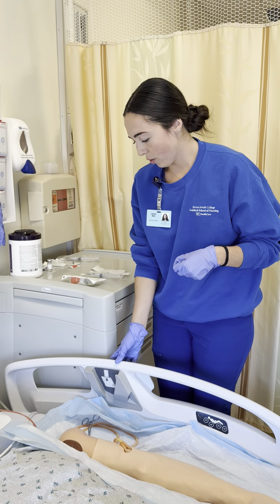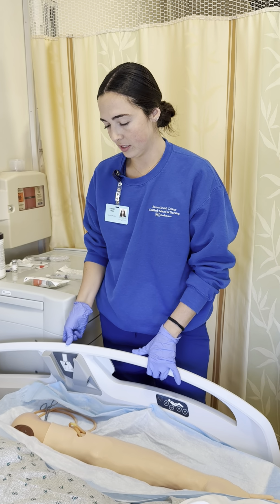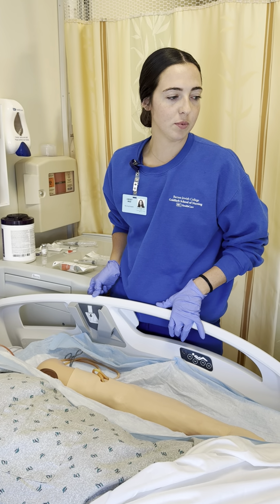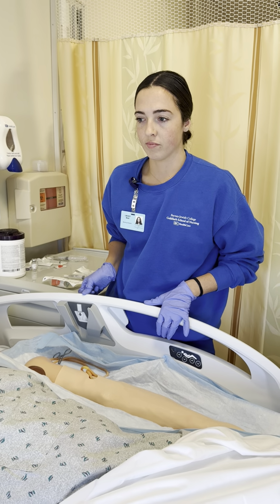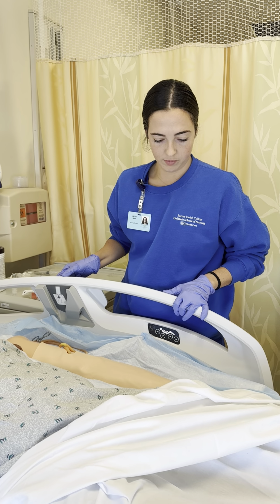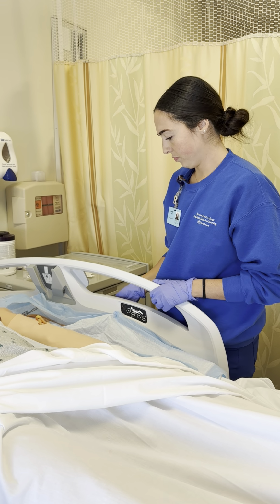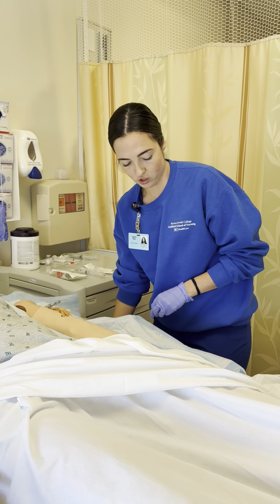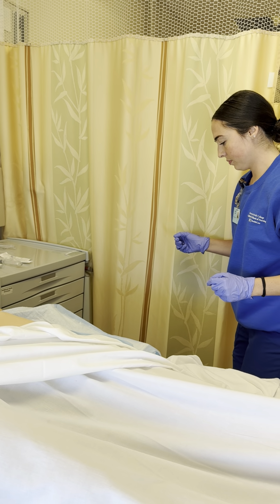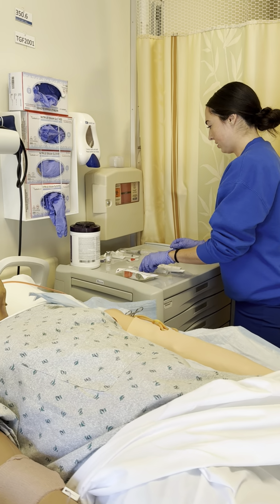So I'm going to go ahead and raise the bed up here, Ivy. I'm going to bring it up to a good working height. Okay, so we're ready. I'm going to drop this side down here. Got my trash can ready to go. I have all my supplies, they're unopened, not expired.